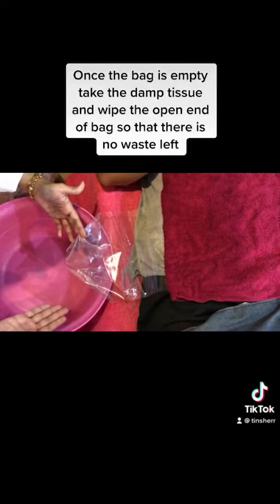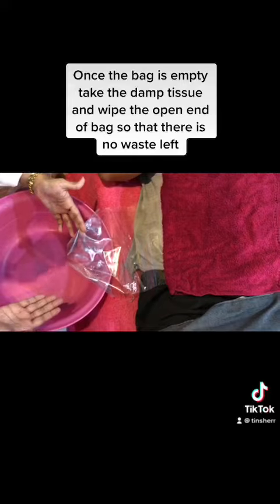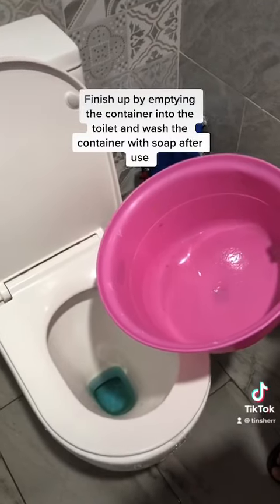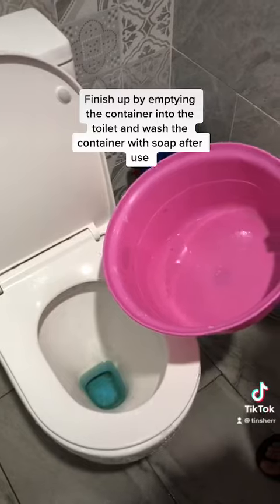Once the bag is empty, take the damp tissue and wipe the open end of the bag so that there is no waste. So this is a damp tissue, so you need to wipe the open end of the bag so there is no waste left. Now you can close the bag. So finish up by emptying the container into the toilet and wash the container with soap after use.